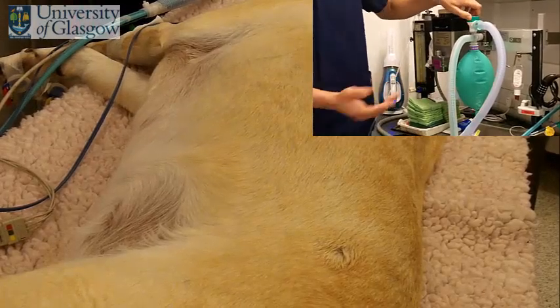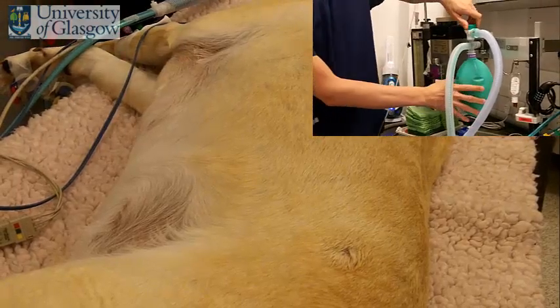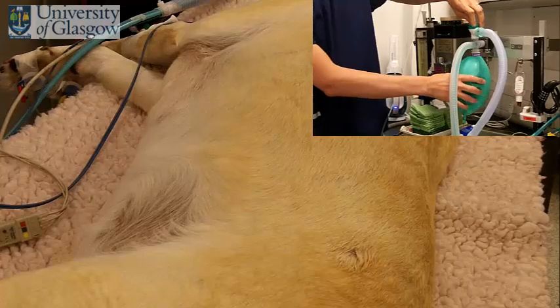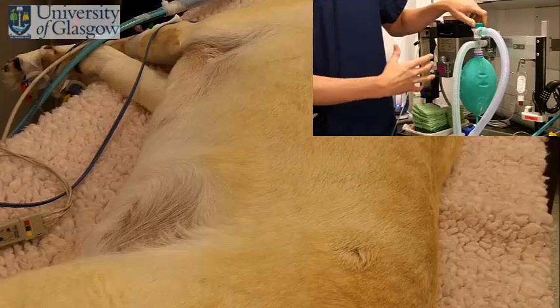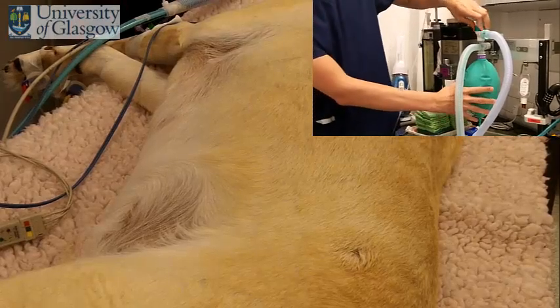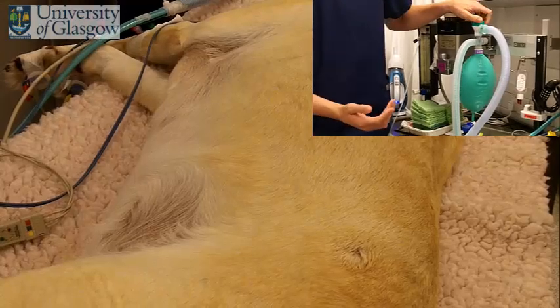It's important to remember that this dog probably only breathes maybe 300 or 400 mils of gas every time it breathes in. Your bag here is 2 litres, so don't feel you have to squeeze the whole bag into the dog's chest, because you'd be massively overventilating it. You just need a gentle squeeze of the bag to give you that normal physiological chest rise.